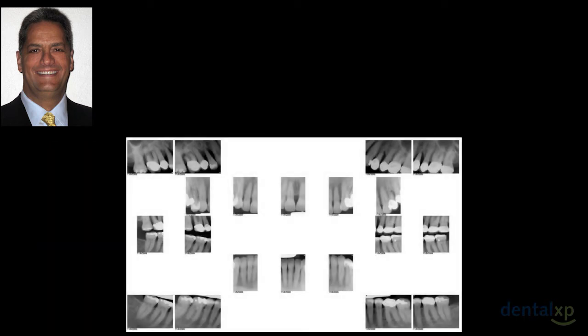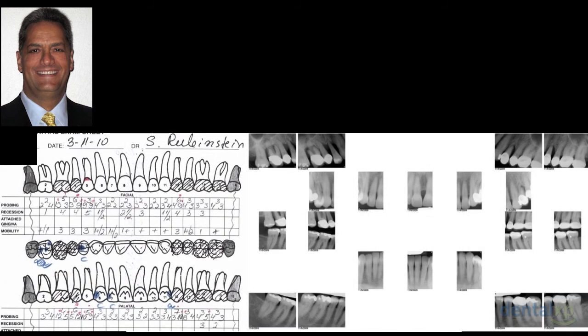When we evaluate the radiographs, we can see for the most part there is stability on the lower arch, and the upper teeth, mostly posterior upper right, have class 3 mobility, and the upper left first premolar has very little bone supporting the tooth. On a closer look through the periodontal charting, we have some pockets on the upper right premolars and molar that are mostly 8 to 12 millimeters, and on the upper left side the premolar has lost advanced bone with a very deep pocket. These 4 teeth in particular have class 3 mobility, so we know that the prognosis for these teeth is hopeless.